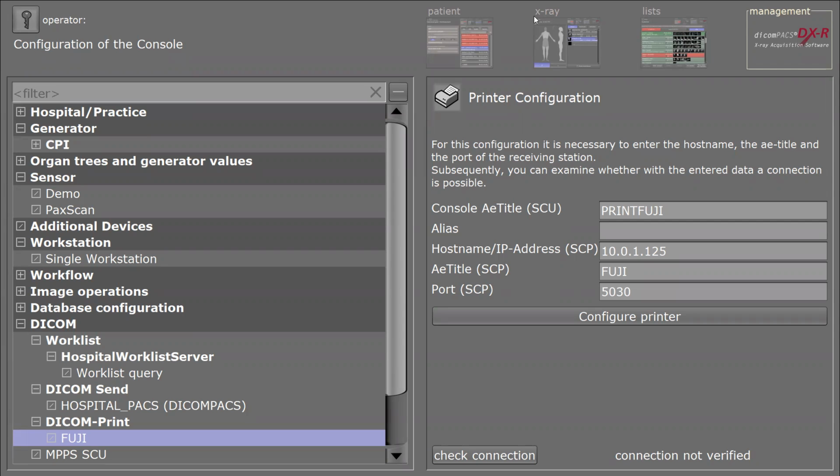Okay, Martin, we have a question. Yeah. Yep. In the case, we install a license, but we cannot print out. We check the connect okay, print okay, but we cannot print out. Do you have any advice to handle it? And any advice to guide us how to do for the test?